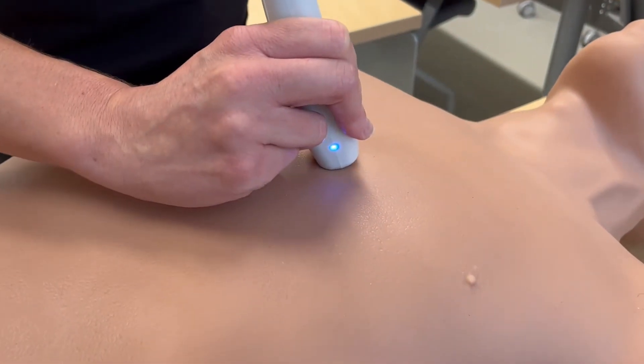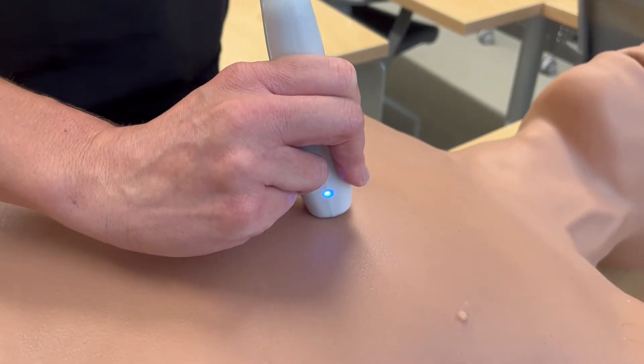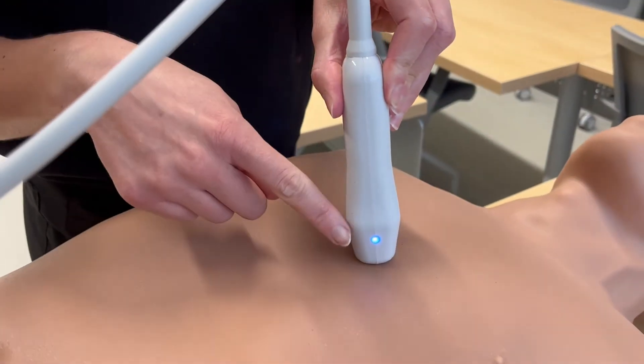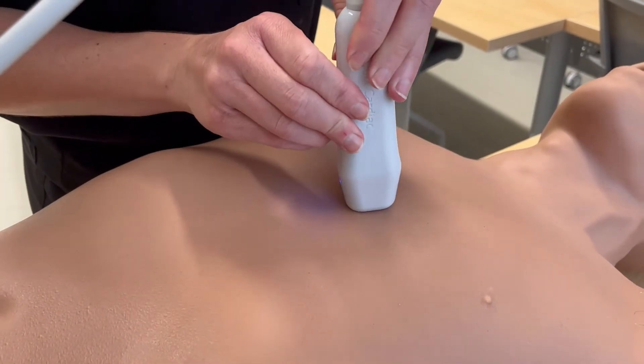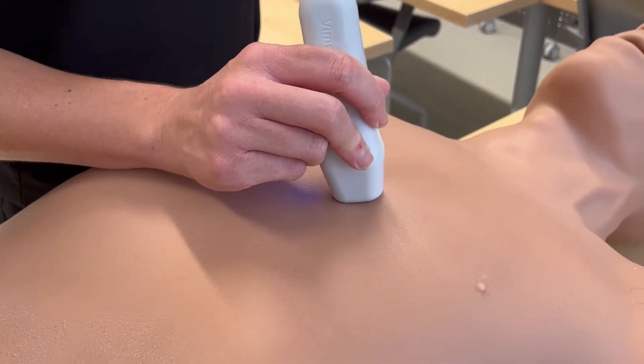The second view in our echo will be the parasternal short axis view. To obtain that, we're going to keep the probe where we had it for the parasternal long axis view, with the left ventricle centered on the screen. We're going to turn the probe 90 degrees, so the probe marker, which was pointing at the patient's left hip, is now going to point at the patient's right hip. We should then see an image like this on the screen.